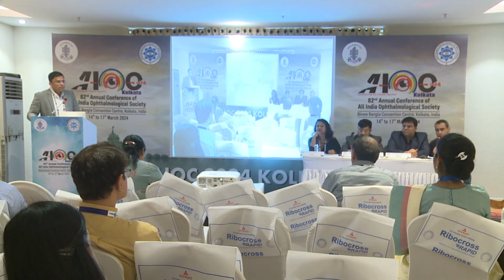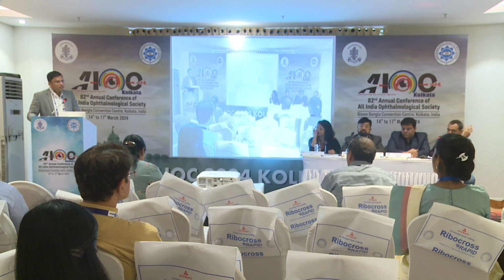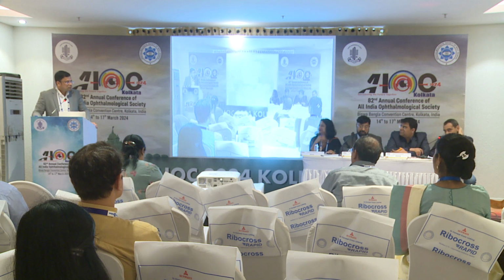You can have a foldable toric aniridia IOL, but the cases are few. That's why there is not much of a thing. Now it's only rigid and probably customized. In future, maybe we'll have foldable toric aniridia lenses. Yes. Good try. I think very nice, very encouraging result. Thank you, sir.